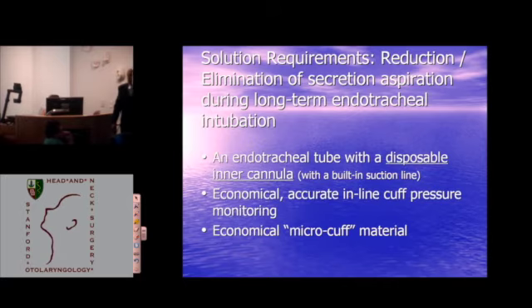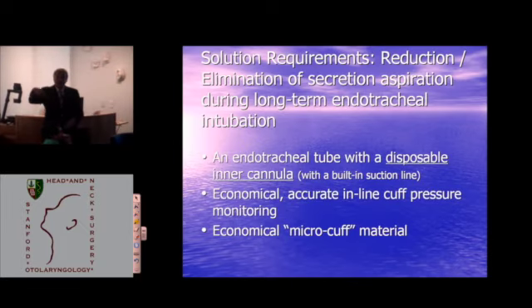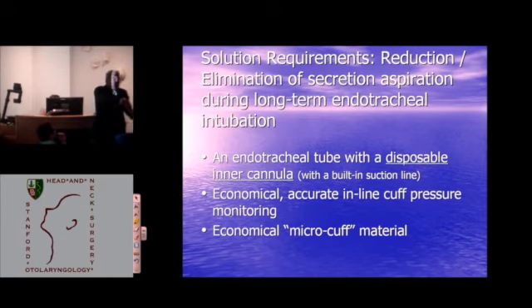But to address big holes in the management of ventilator-associated pneumonia, not only do you have to be able to remove that junk from that tube that's sitting above the lungs for 6 or 7 or 8 days until the patient goes to trach, and there's two people that have inventions out there. One is a catheter that goes down through an endotracheal tube. You blow up the balloon, and then you pull it back out and try to take that stuff out this way. The other is a brush kind of an apparatus.